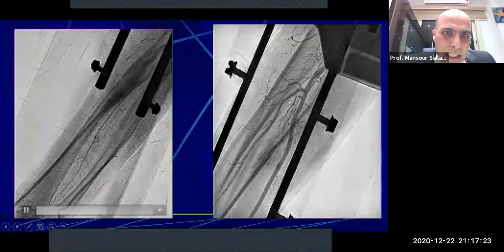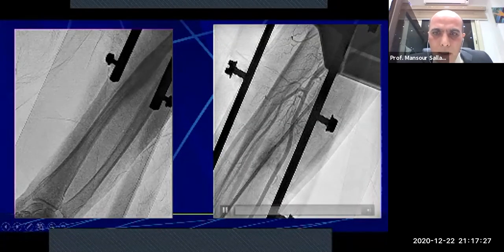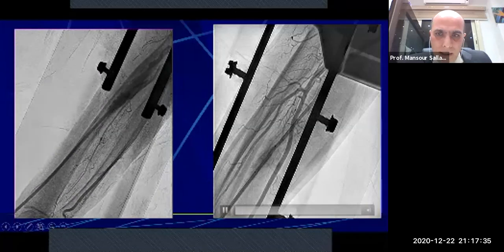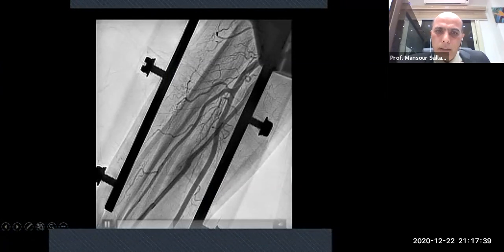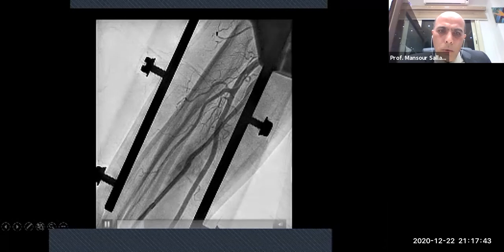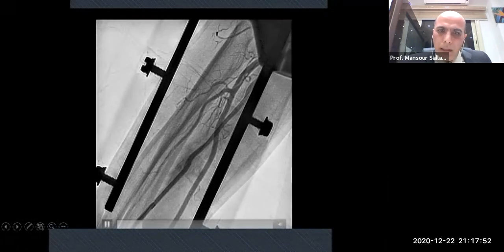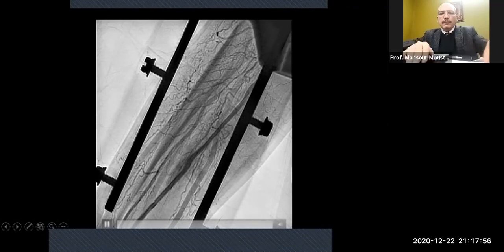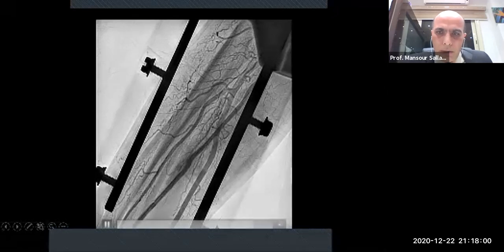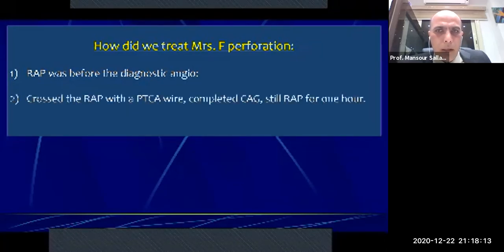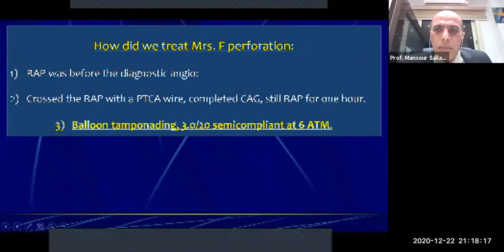Unfortunately, after catheter removal, bleeding persisted. So we did balloon tamponading — a 3.0 mm, 20 mm balloon inflated at 6 atmospheric pressure for approximately 20 minutes. After that, we maintained flow, there was no more bleeding, and the artery kept open. If we had used external compression with a sphygmomanometer cuff, bleeding might have stopped but the artery would have collapsed and occluded. The lesson for Mrs. Fatma: perforation occurred before diagnostic angiography — we crossed with the PTCA wire, completed the procedure, and balloon tamponading helped when the catheter failed to seal.